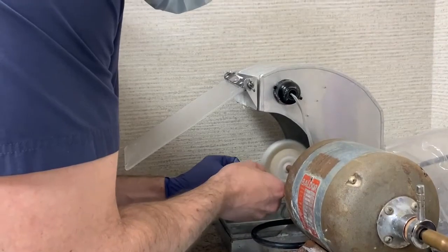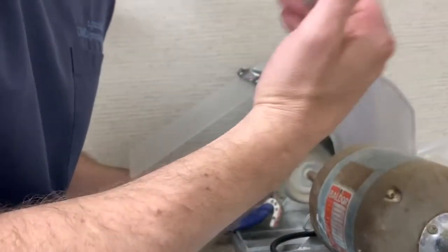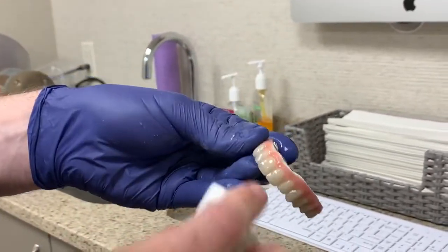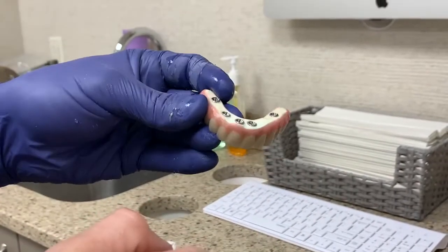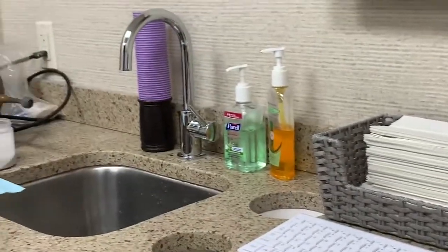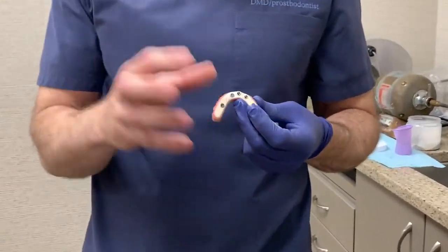You have to polish this thing. When the lab does this, they put a glaze on it. This is where I adjusted it, but it's got to be super smooth. They paint a glaze on it. You can see where I adjusted; it's whiter, and then here they have that glaze. A lot of people use a glaze called Pala glaze, I believe it's a Kulzer product, and then you light cure it.